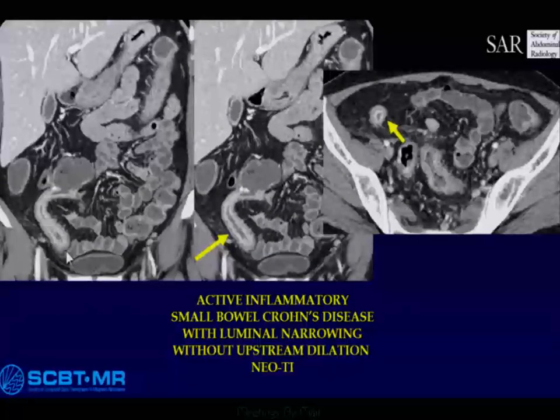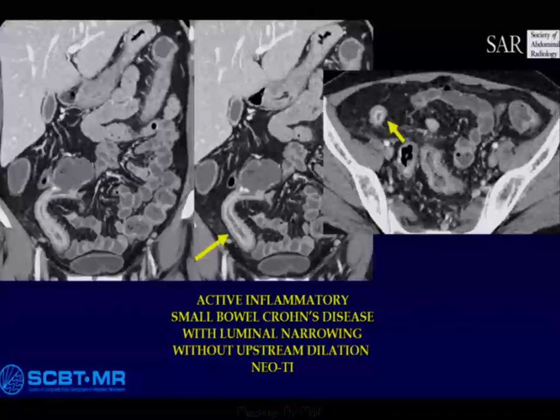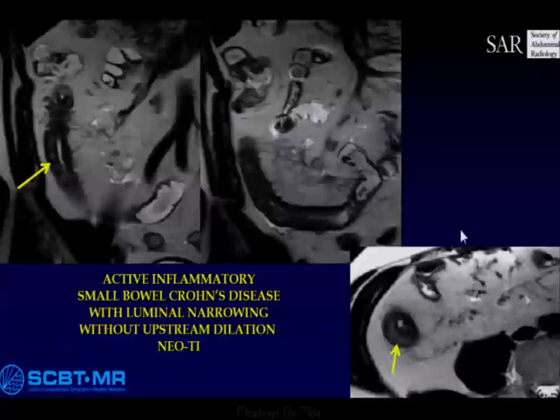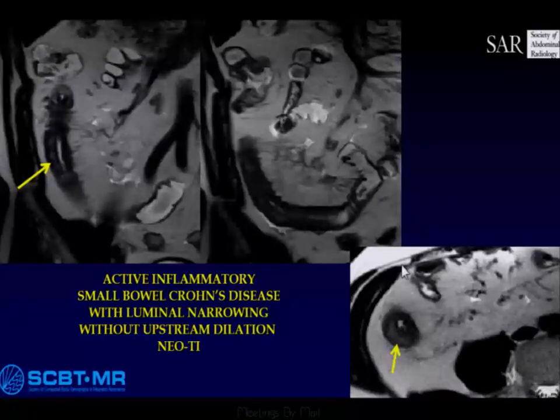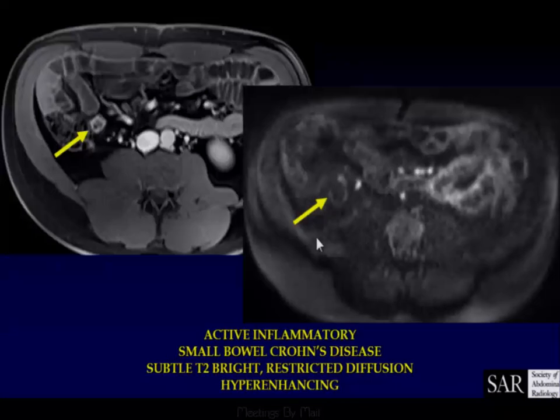Here's an example of the stratified hyperenhancement pattern. I don't use the word mucosal because most of the time the mucosa is gone, so it's just stratified — we don't really know what this is other than a lot of active inflammation. Wall thickening, we can see distended vasa recta. Here's the MR: T2 bright, wall thickening, no luminal dilation upstream but luminal narrowing at the site of active disease. And here's fat-saturated T2 increased signal, the hyperenhancement, and restricted diffusion.